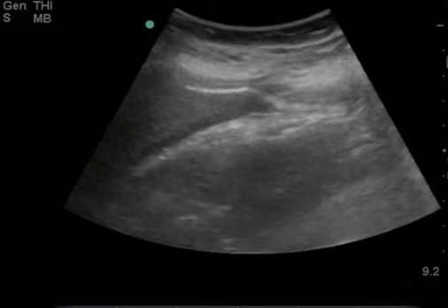In this case, without having any lab work back, not knowing that the patient was pregnant, the ER provider was able to convince OB to come in, given that he had seen the gestational sac and knew that she was pregnant. And though the differential does include a ruptured ovarian cyst, this is really ectopic pregnancy until proven otherwise.